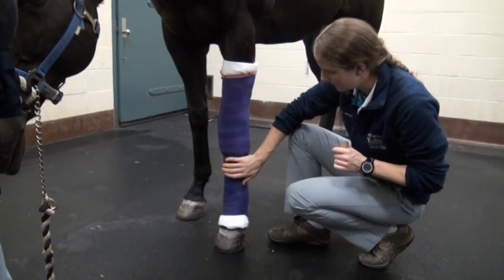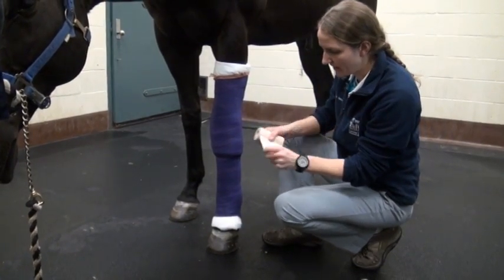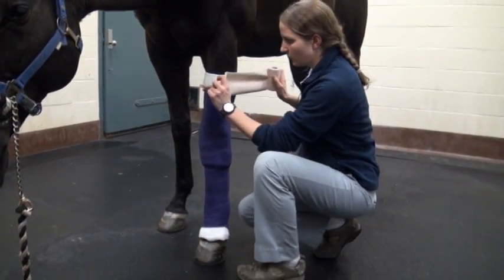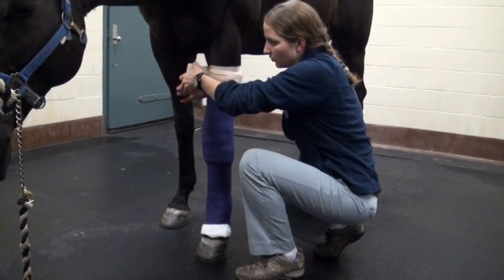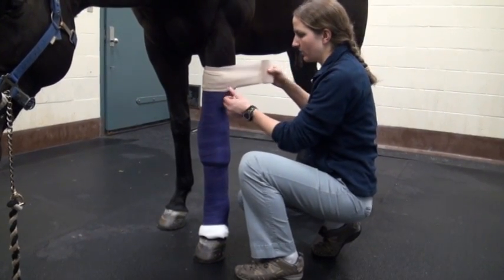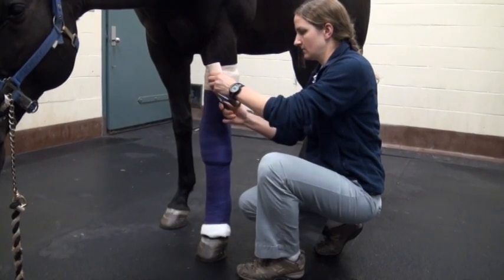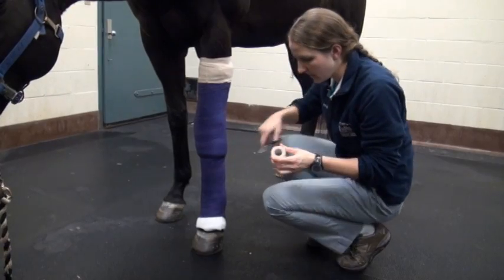Once your vet wrap layer is on, your next layer will be your elasticon. This is an elastic adhesive bandage that we want to apply with relative looseness. Approximately 50% will go onto your bandage and the other 50% on the horse's leg. You want to take this around once or twice and again apply it relatively loosely, so once you've stretched it, allow it to snap back before applying it. And this should be repeated at the bottom of the bandage.